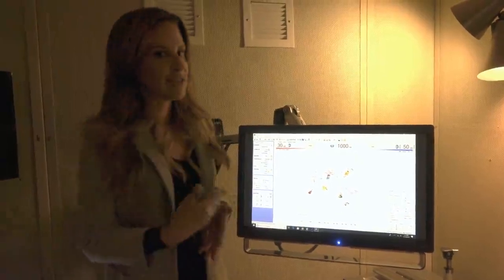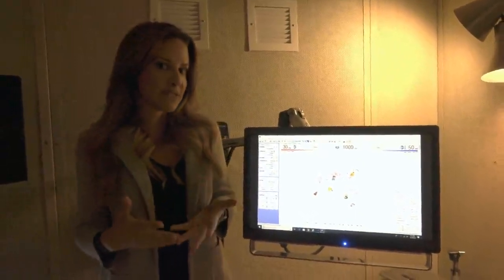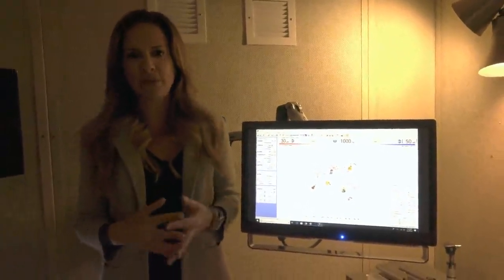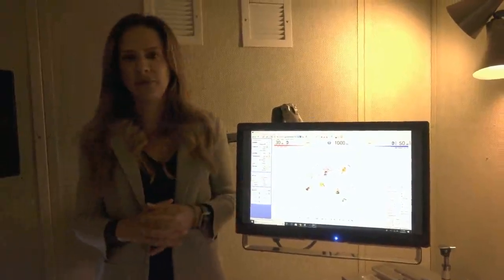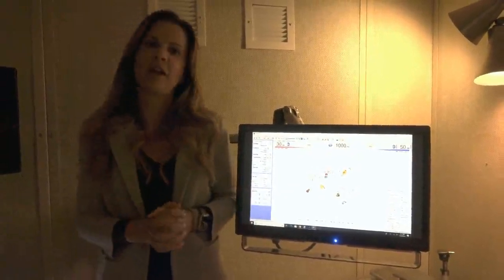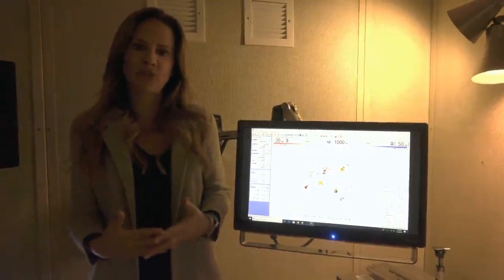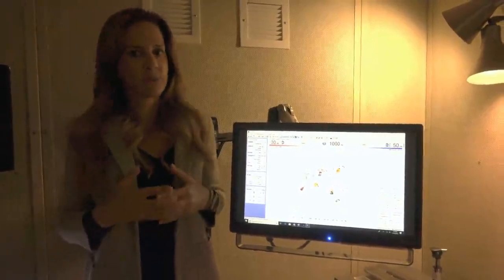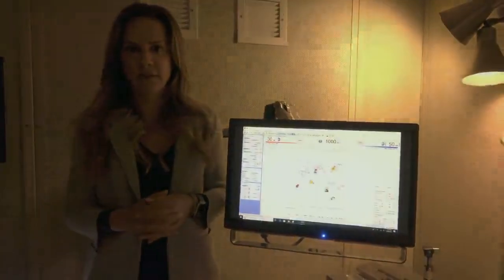So for patients like this, our recommendation would be a device. It would be what's called a receiver in the ear that has a really great noise management system, because our low frequencies are responsible for volume, and our high frequencies are responsible for clarity. So we want to be able to maintain that volume so you can hear people around you. However, we want to extract those speech details so that you can grab them in complex listening environments.